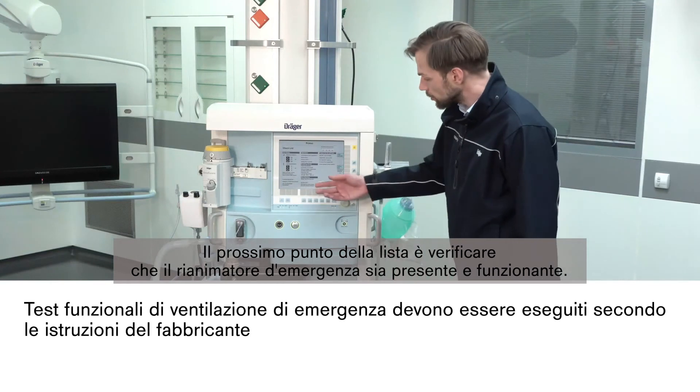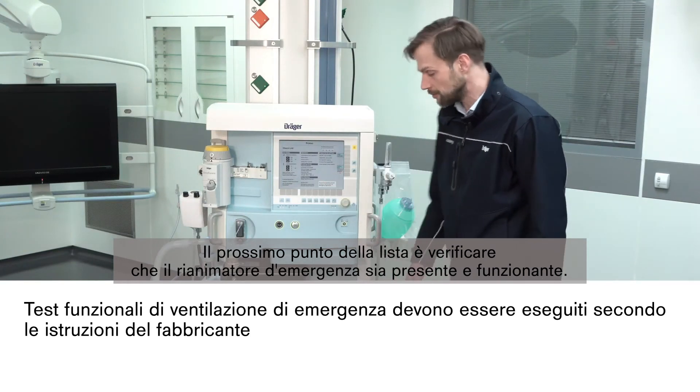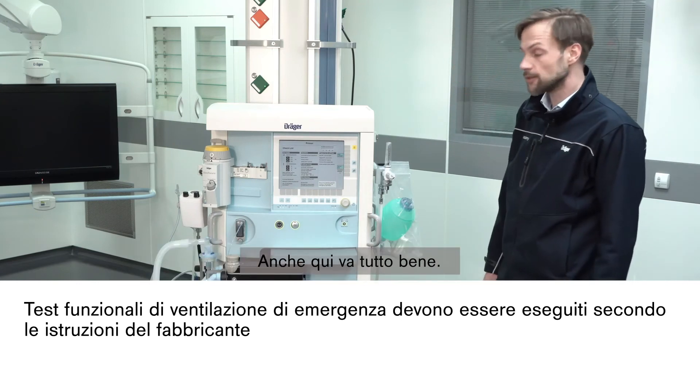Next on the list is to check if the emergency resuscitator is present and functional — and yes, this is the case as well.